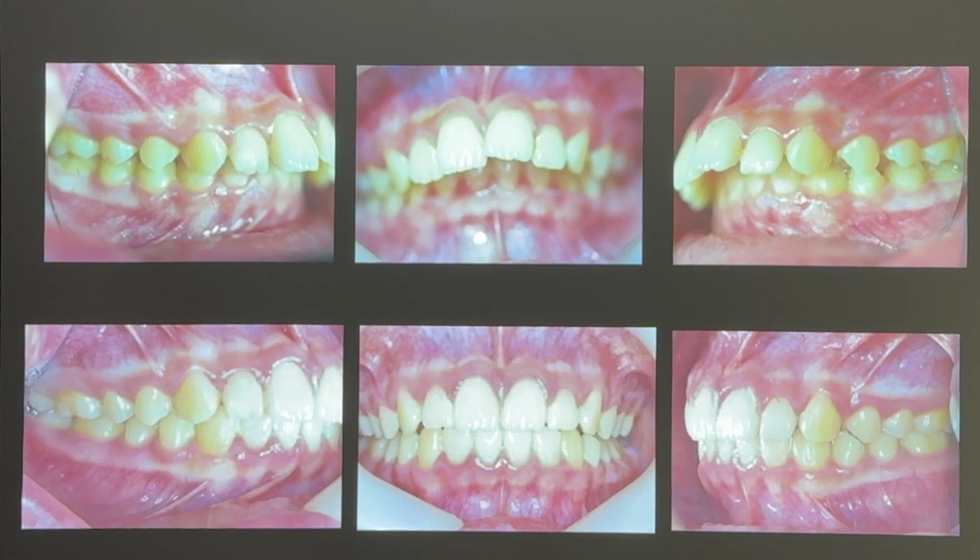Another one is thin lip tape. The skin tape, you already know the brown color of skin tape. Using that one. But we have a stronger level.